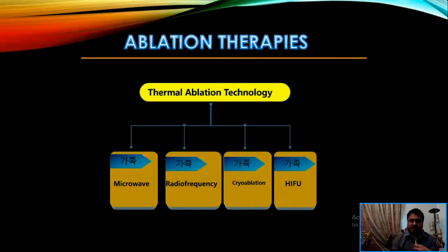These are the available thermal ablation therapies worldwide. In our country, we do only radiofrequency ablation and microwave ablation. As far as our departments are concerned, I know that there is no availability of cryoablation or high intensity focused ultrasound ablation.